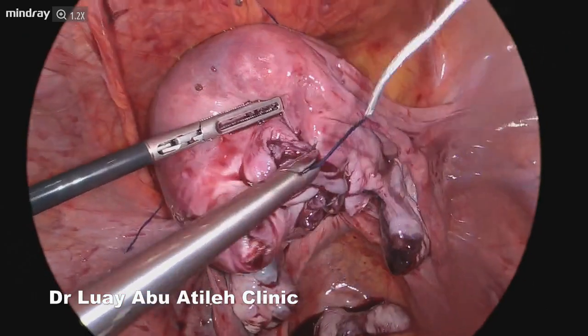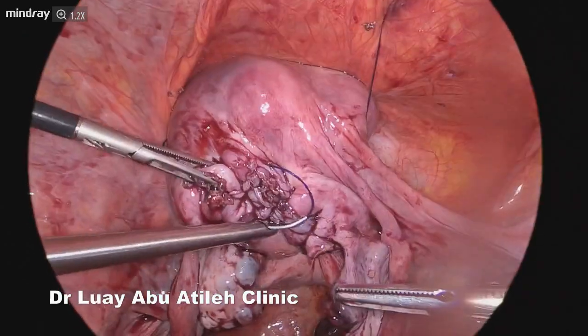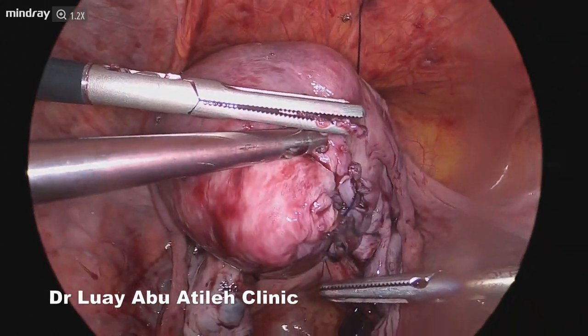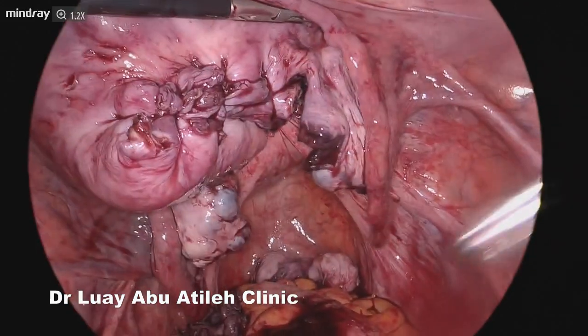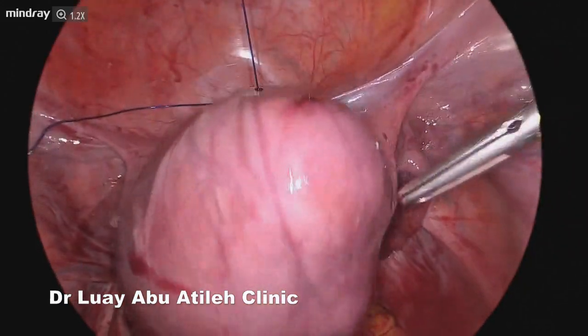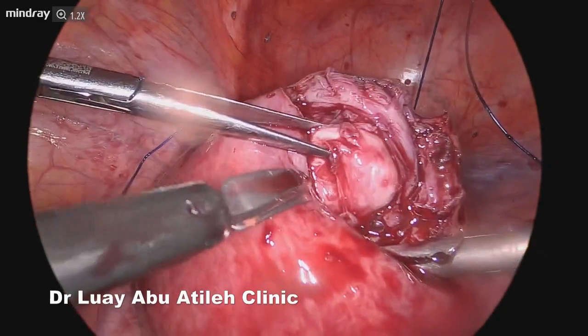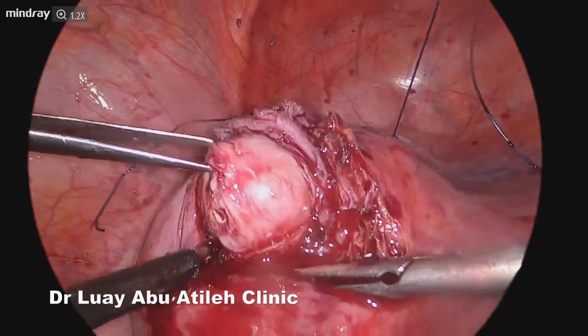Even the suturing was different from usual — we normally depend on our speed in suturing and reconstructing the uterus to outpace the bleeding process. With this technique, we noticed we did not need to be as fast as before. We also used barbed sutures, as always, which is another measure to decrease blood loss in laparoscopic myomectomy.